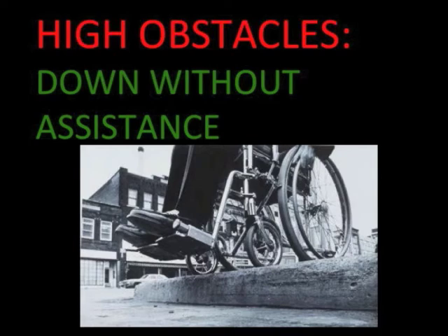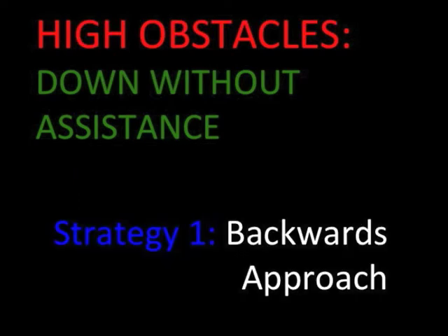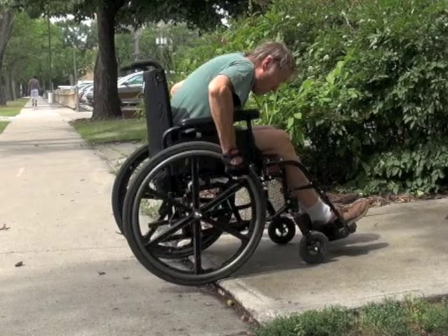The backward approach is the easier and less intimidating method for getting down a high obstacle. The greatest risk is a backward tip if you do not shift your weight forwards or if you stop suddenly. Another potential problem is catching your foot rests on the higher surface once the drive wheels are down.